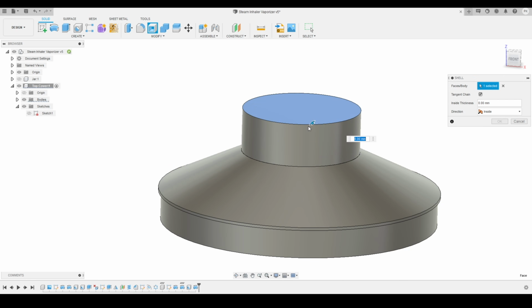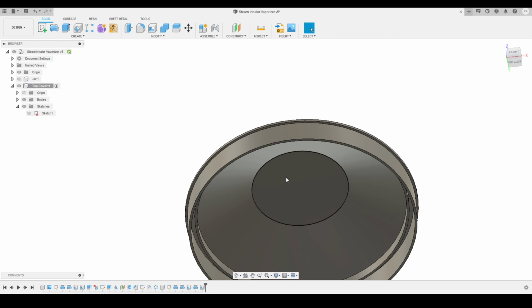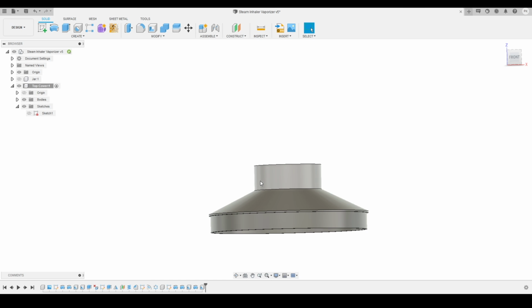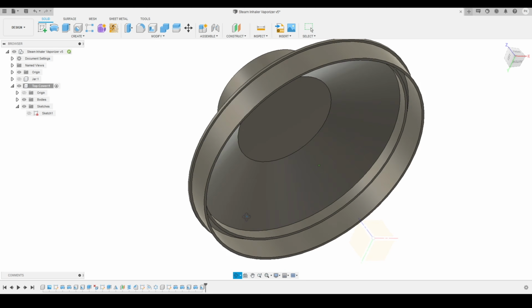I will activate the shell tool, we'll select the top body face, apply the thickness, and press OK. Here you can see the result we get so far, after applying a few tools like revolve and a few shell tools. So this is the result we are getting for the top cover.